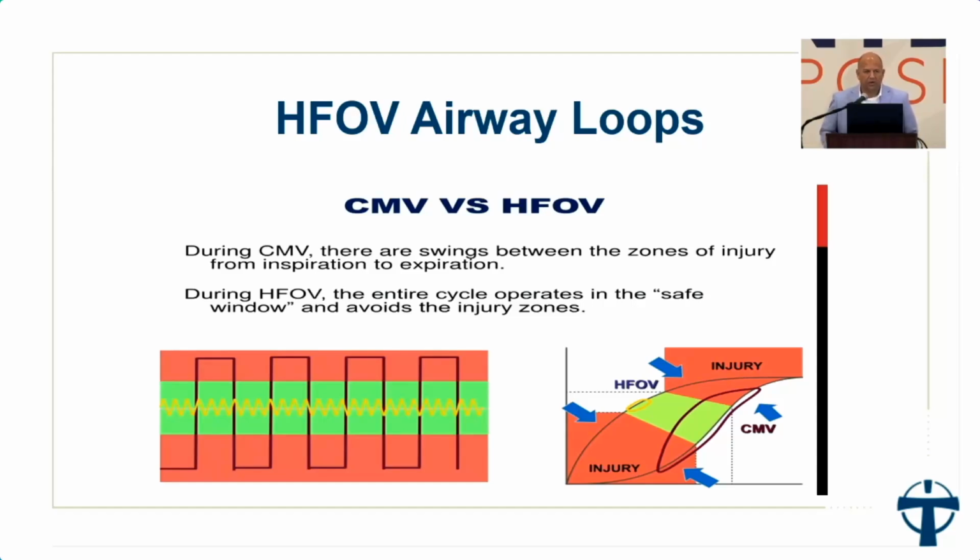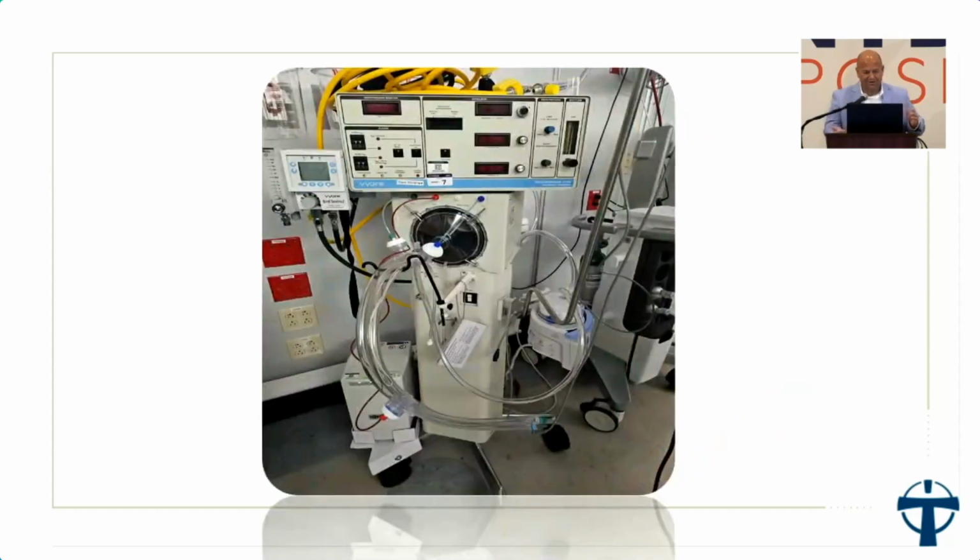There in oscillator, we have just constant pressure of blowing air or blowing volume into the patient. And you can see again on the right side, it shows a little bit. What happens with an oscillator really is a biphasic flow, like a dual lumen cannula in theory. So you have the oscillator circuit, which I'll show you, kind of like this. It's a big, ugly, scary machine. You roll it in. It's loud. It's obnoxious. It takes up all the room in the unit or in the patient's room.